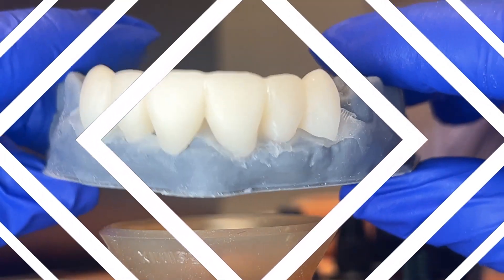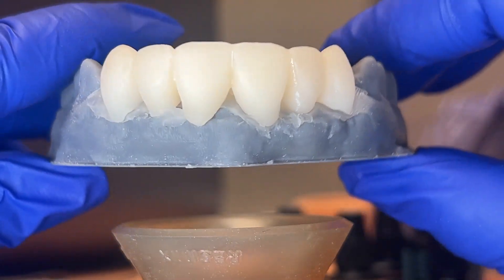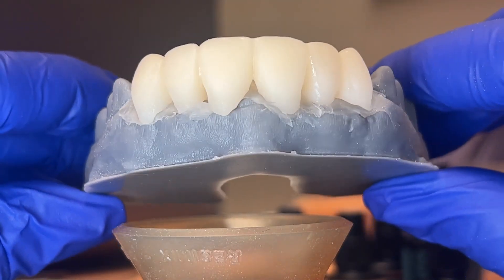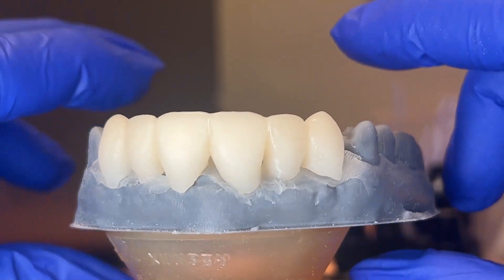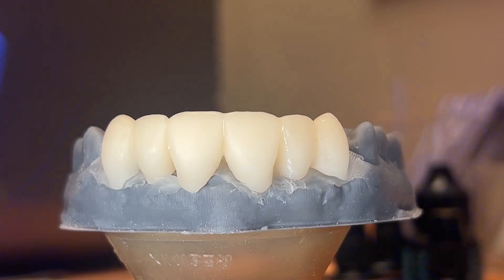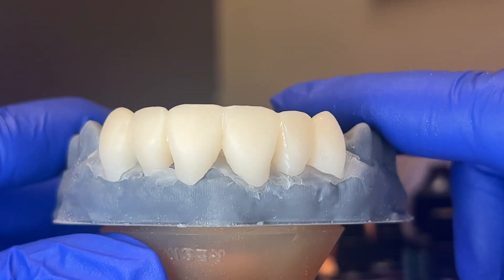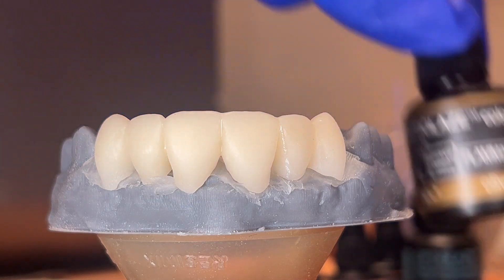So this is just some teeth we've printed. We're going to make an Essex retainer — this patient has gotten three implants right here. We're going to do a zirconia bridge, but we want to make these teeth really pretty so he has something to look good in the meantime. I also like any excuse to practice my stain and glaze skills.